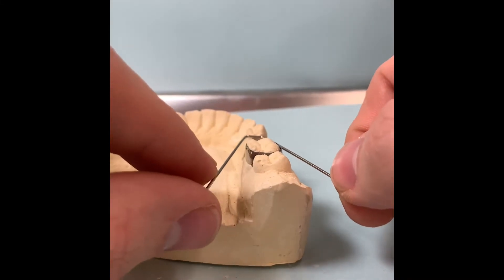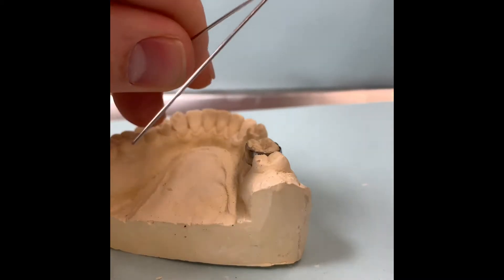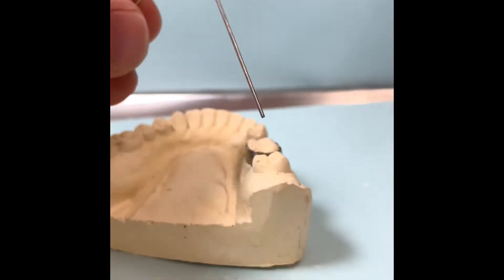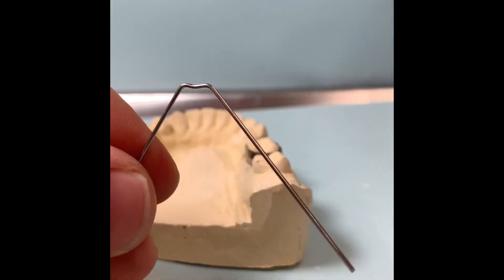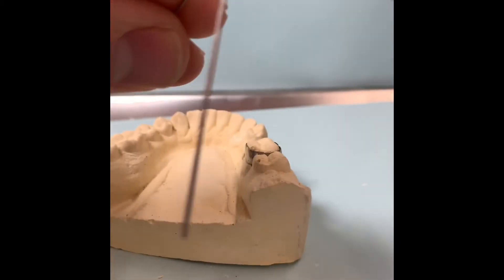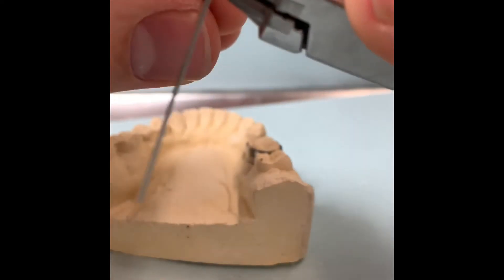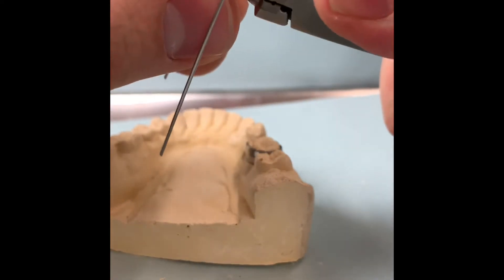Then we place it, make sure it's good. And then with our 3-pronged plier, we're just going to make a little indent to go in, so it becomes like a little W or an M. And then make these two wires go in just a little more.